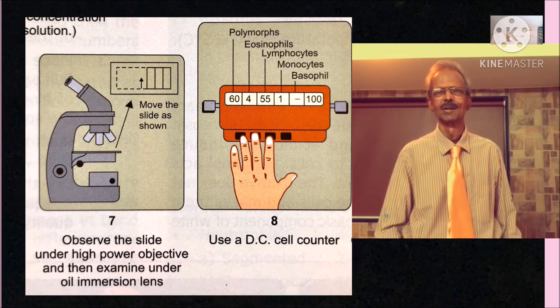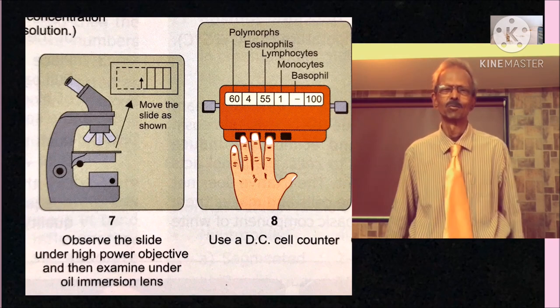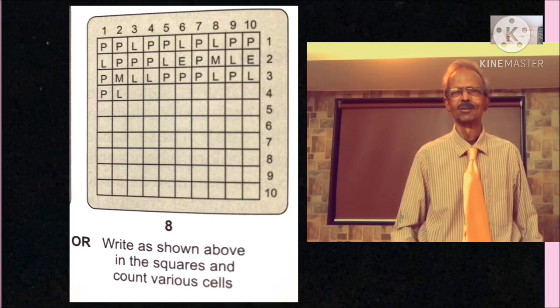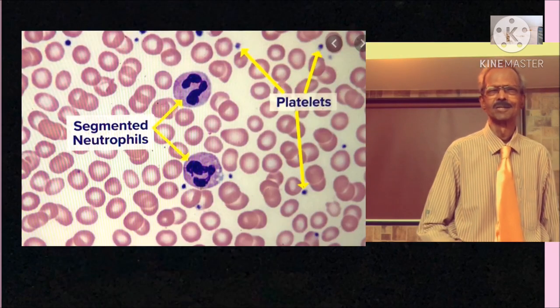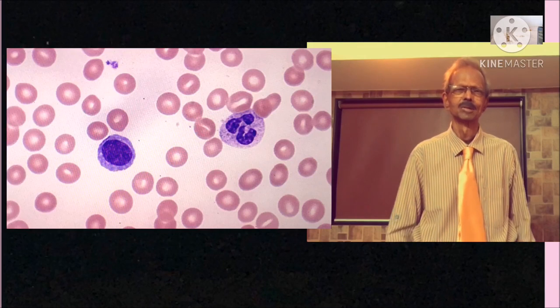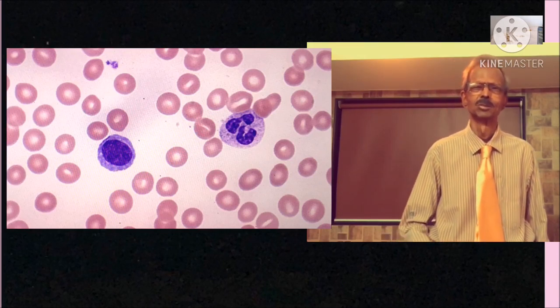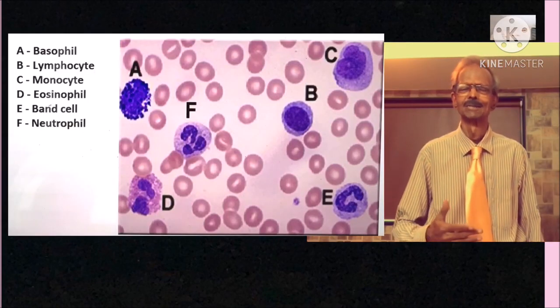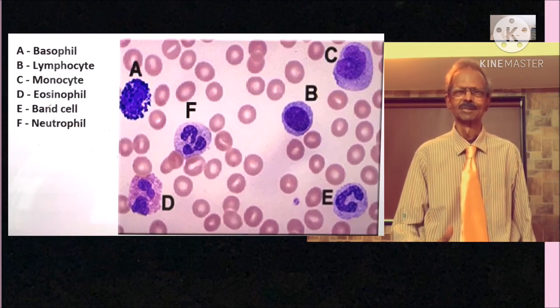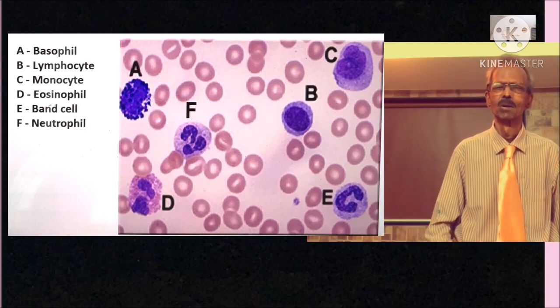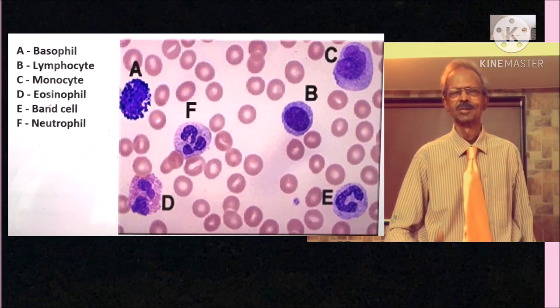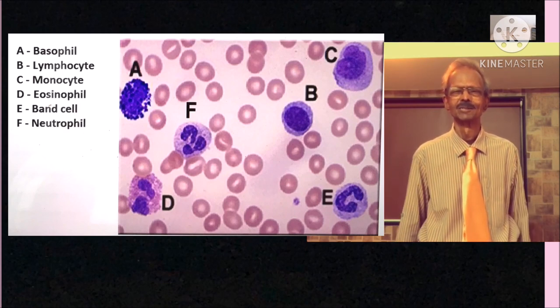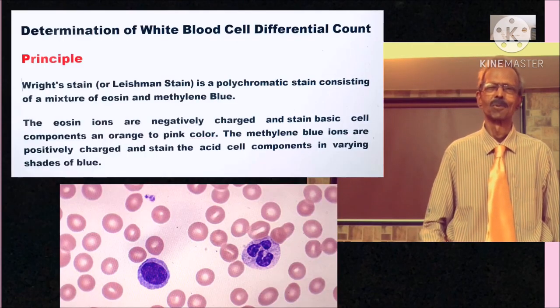Next, first observe it under low power microscope and select good evenly spread portion of the smear. And place one drop of immersion oil and then carefully adjust the microscope using oil immersion lens. Count different white blood cells using a cell counter or write as shown on the paper on the left hand side. See in this smear, you can see 2 neutrophils and few platelets. And in this smear, you can see 1 lymphocyte and 1 neutrophil. Identify and count different white blood cells as shown in this figure. Like A in this figure is basophil, B is lymphocyte, C is monocyte, D is eosinophil and E is a neutrophil.